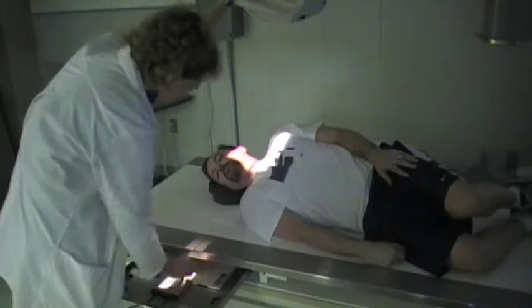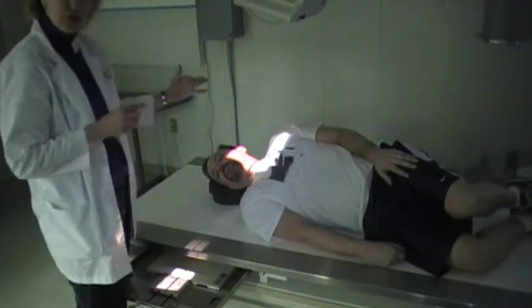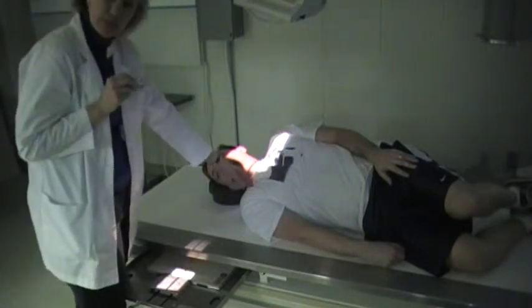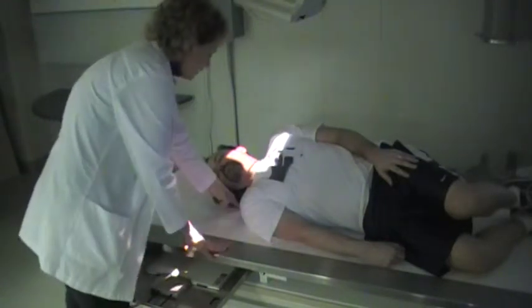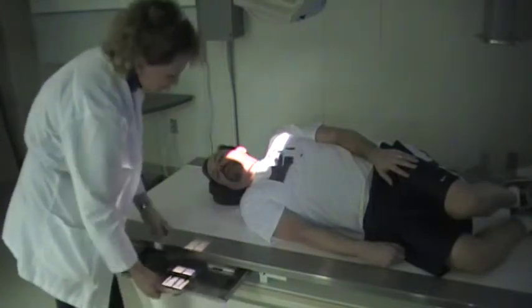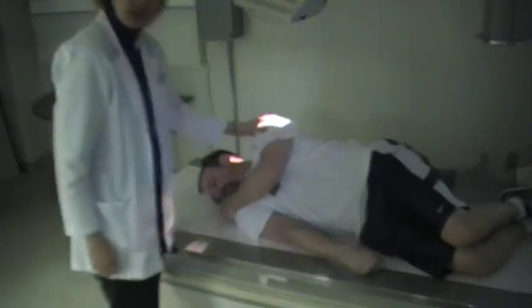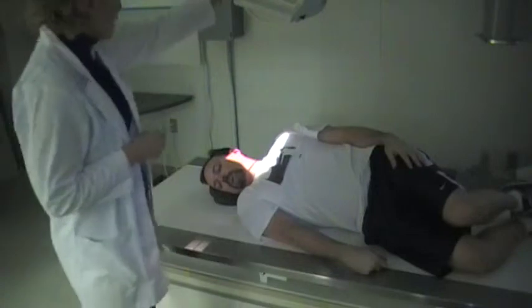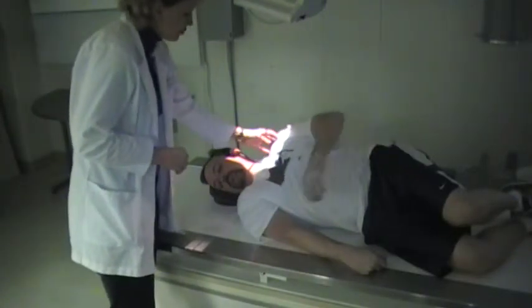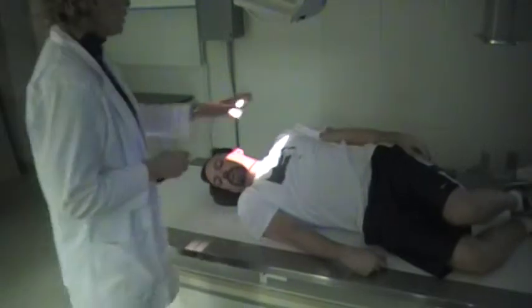Since it is the AP oblique, once you have your patient turned, double-check your marker. Since he is to his right side, you're going to mark the right side of the image receptor, or you can place it on the right side of the neck. One other thing to check when doing obliques is that a patient will often want to roll up their shoulder — watch out for that because that shoulder will be right in the beam and it's not going to make a pretty image. Make sure that shoulder is back so you don't see it casting a shadow in the middle of the neck.